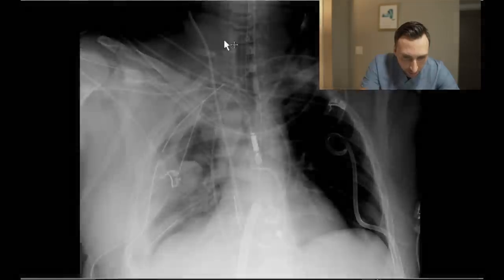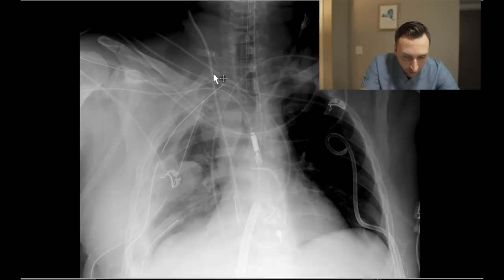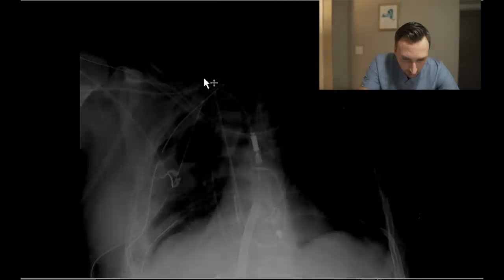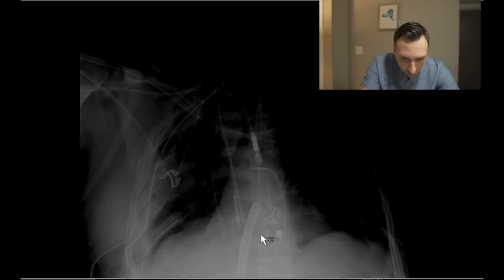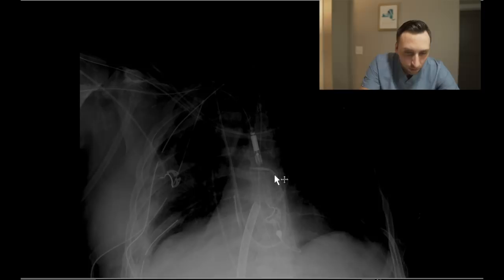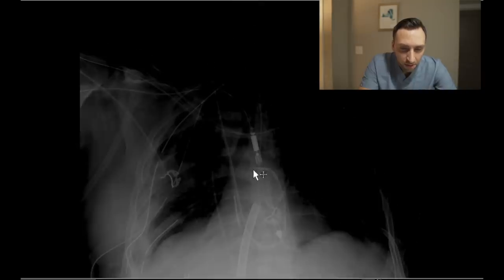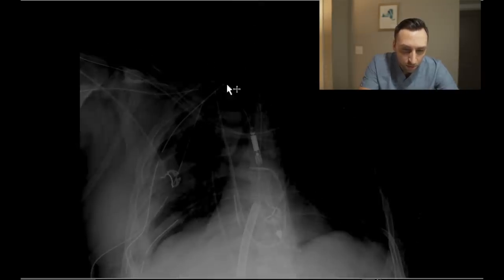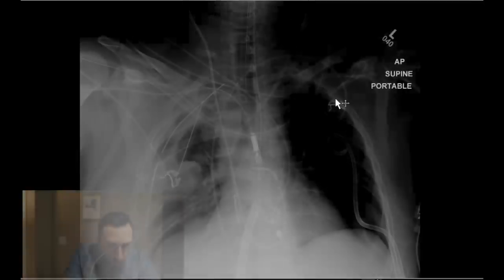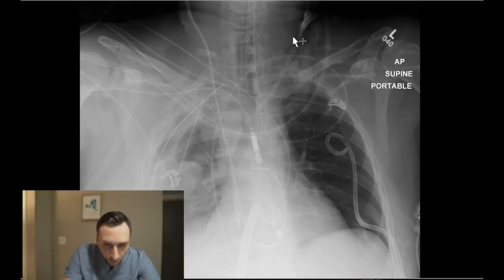The next thing I see is a right IJ approach Swan-Ganz catheter. I'll try to follow this one down for you — here it is coming in the neck right here, coming down, looping around through the right ventricle and right ventricular outflow tract. These can be advanced and pushed into the right pulmonary artery as well, but this one is in kind of the neutral position.